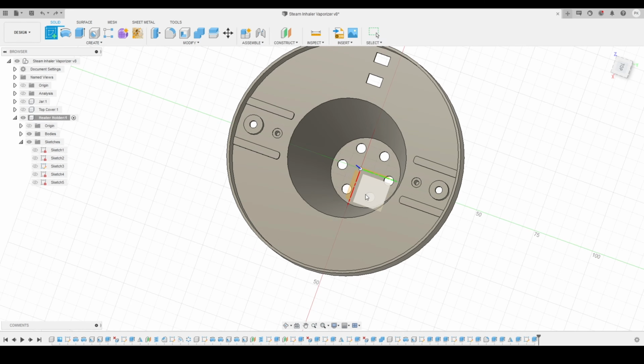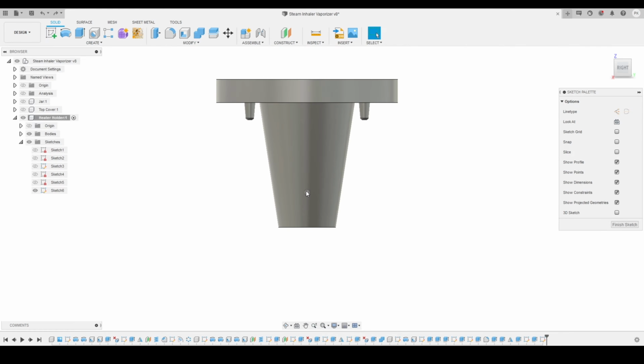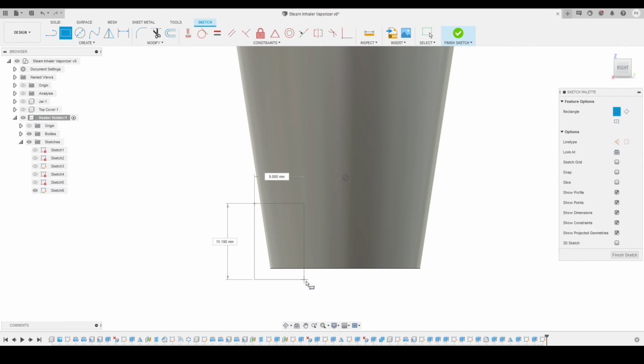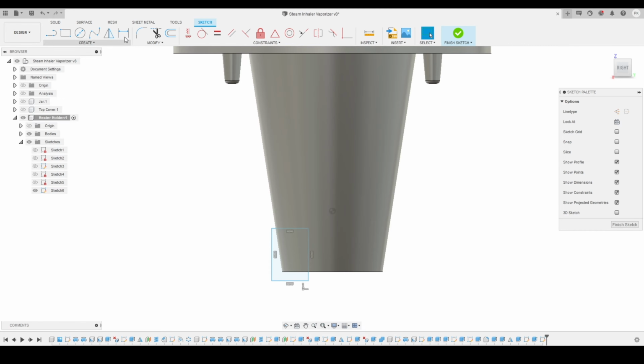Now I will activate the sketch tool, and I'm going to select this face as a sketch face. Here you can see, and now I will start creating this sketch. I'm just going to create a wedge shape over here. For that I'm going to create a simple rectangle like this, and now I will define the dimension of this rectangle with respect to the origin. So this is just 18 millimeters.